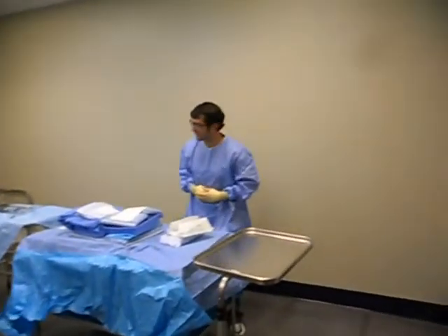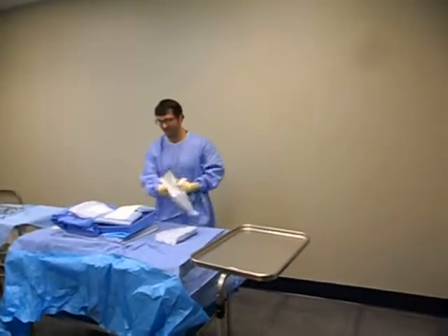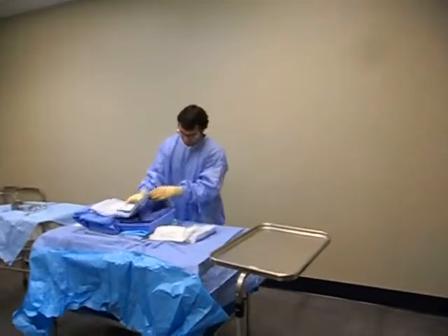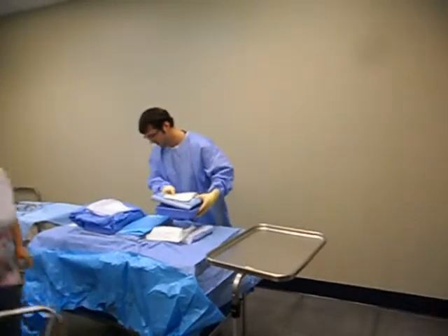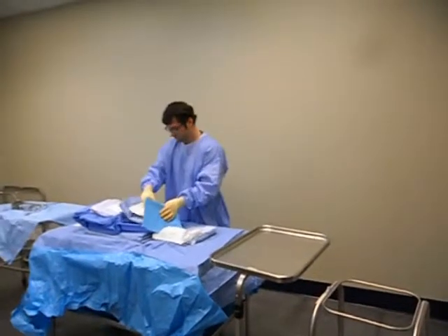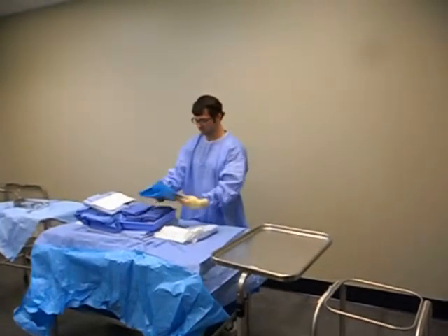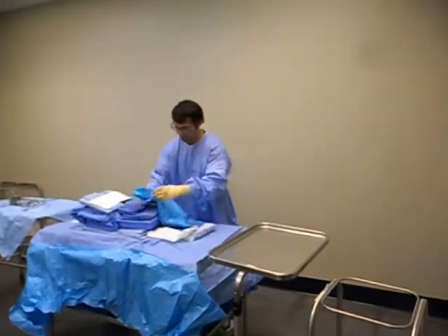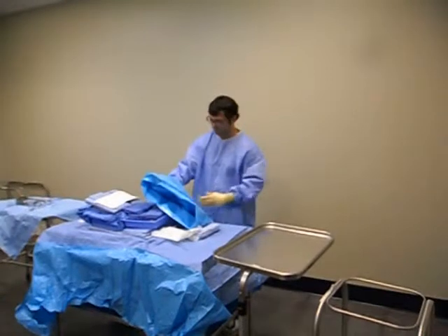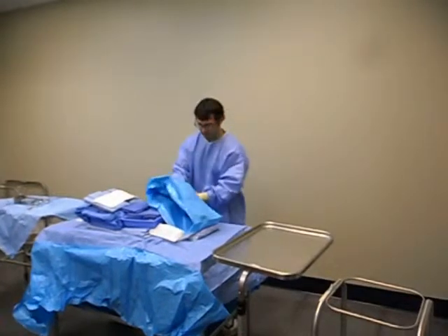Someone switched all my stuff around when I wasn't looking. Alright, so I'm going to get rid of this. You can leave it. Okay, I'll leave it. So let's go on here. I have the tree, some of this stuff. Mix this in. Other way. Okay. Right hand, is it? Okay. Left.